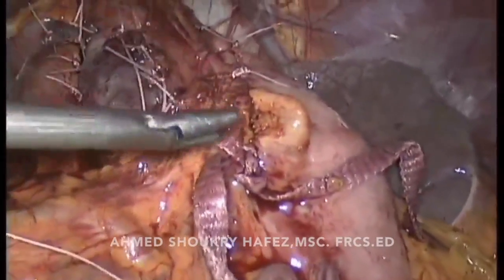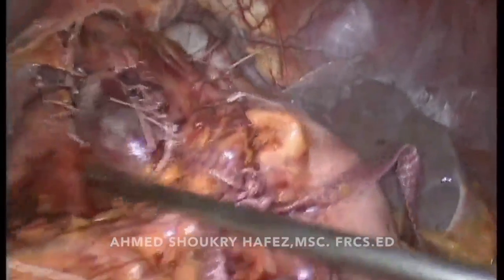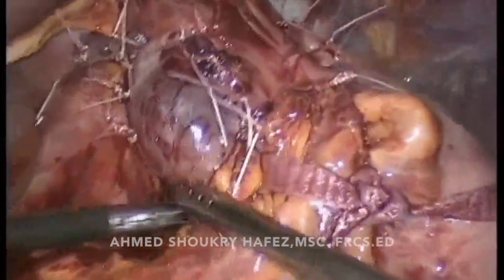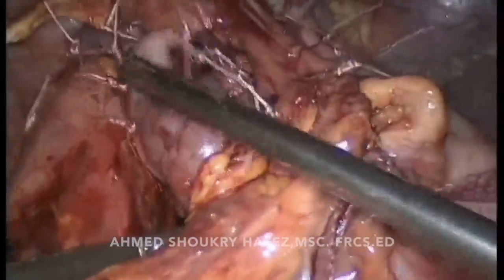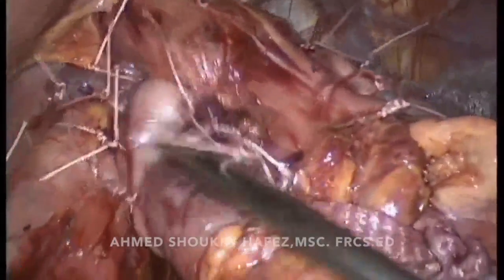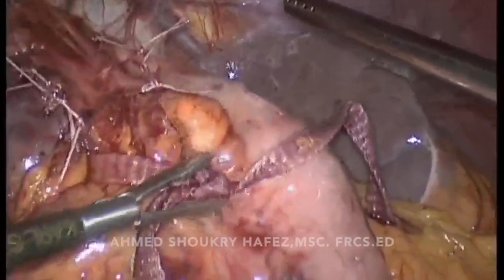Now the wrap has been completed on either side, leaving the anterior part of the esophageal wall free. 270-degree wrap, and you see it lies very nicely anatomically on either side of the esophagus. It's not too tight. It is well fixed posteriorly. The crural repair is quite good, and you have a very good length of intra-abdominal esophagus that has been restored.